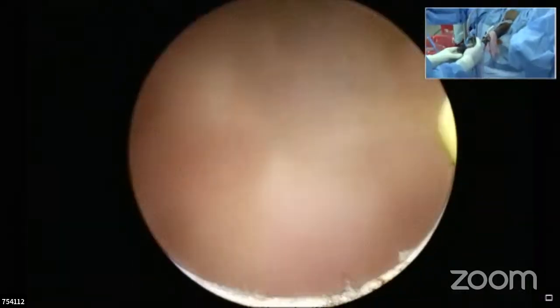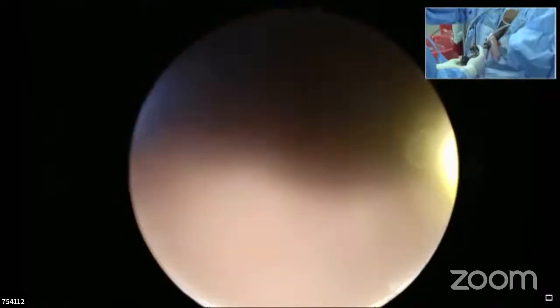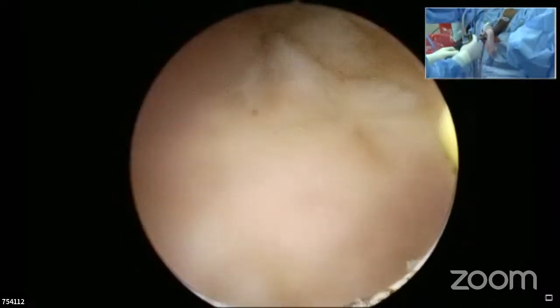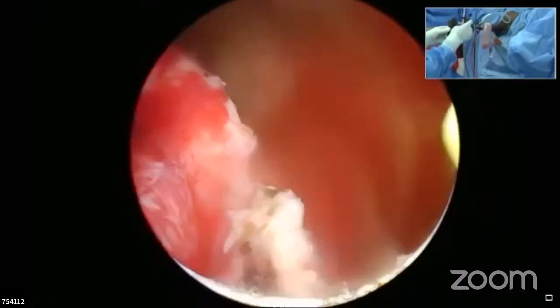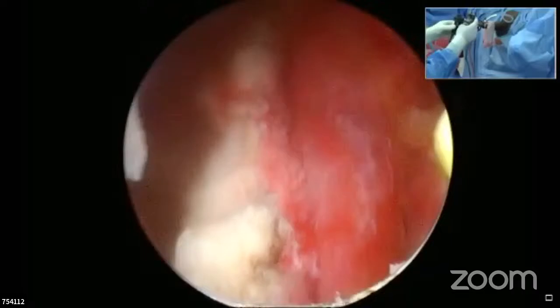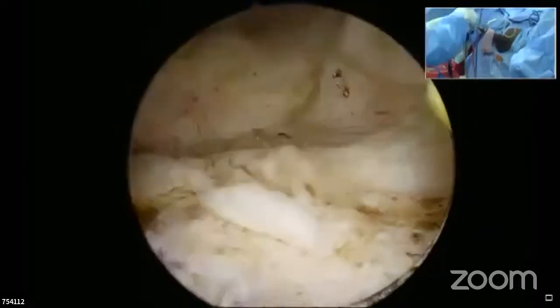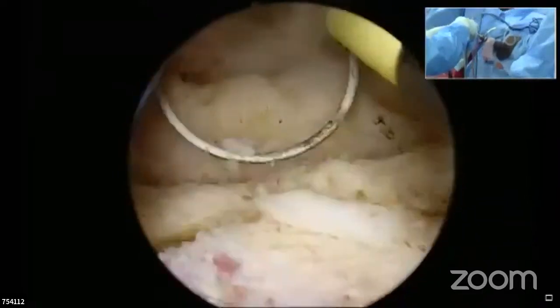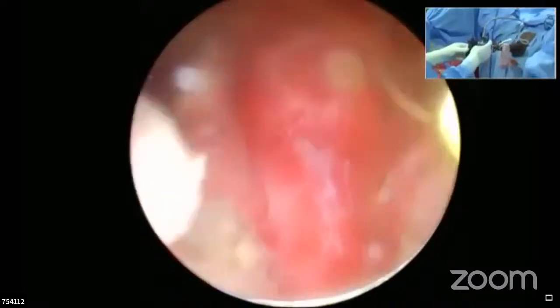Taif, so this is the fossa at the end, sir. View from the Veru. Most of it is debulked. Some amount of few nodules are there which can be toileted off, shaved off. And this is the apical region. We have excavated sufficiently from here. Small tissues left behind. I can dissect out a couple of things here further. So otherwise, bulk of it is done.